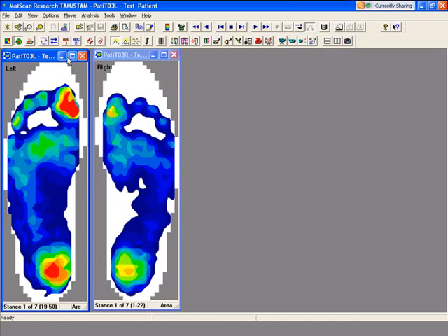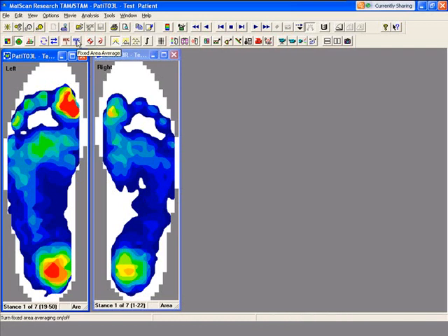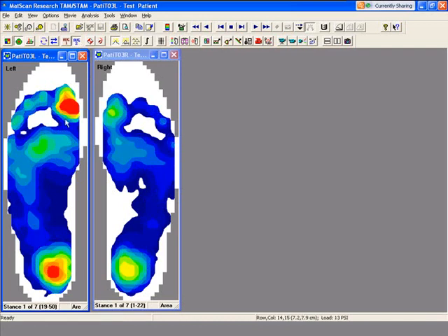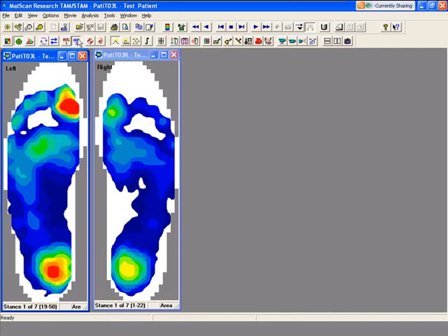Averaging 2, however, will only average active sensing cells. When I click on average 2, you can still see it averages everything and smooths out those lines, but it only averages active sensing cells.